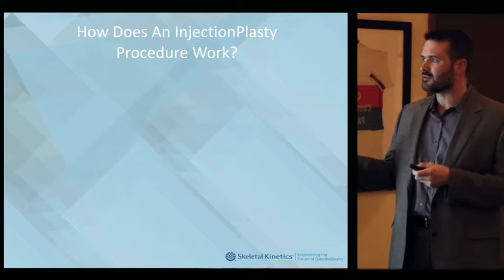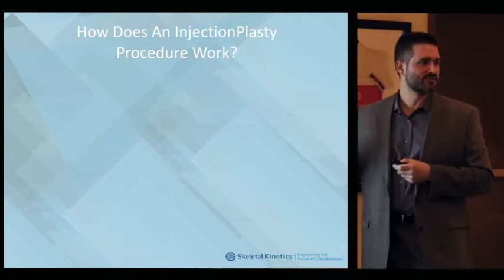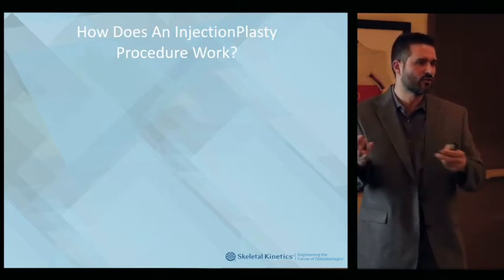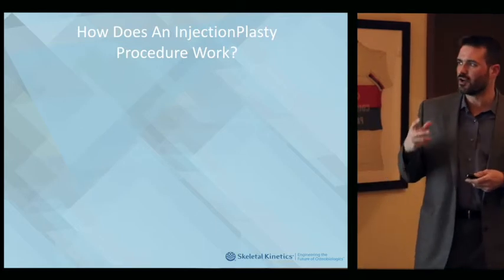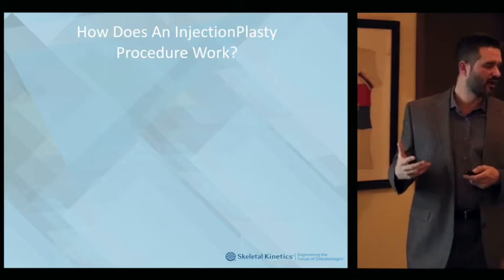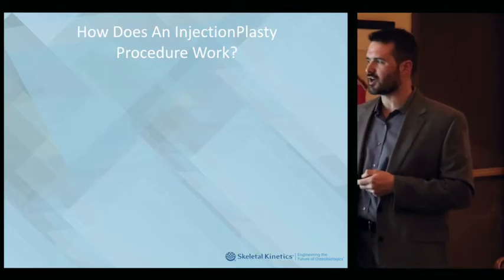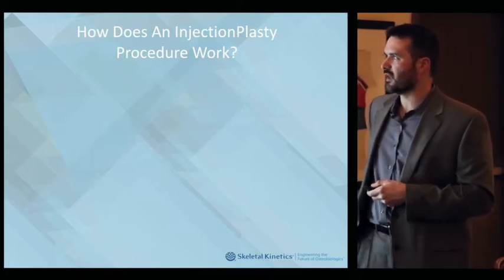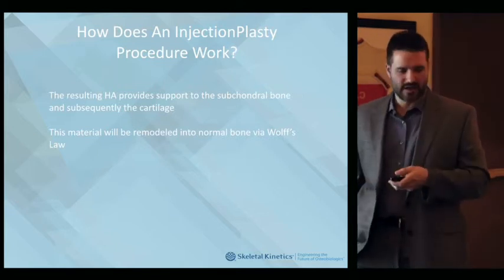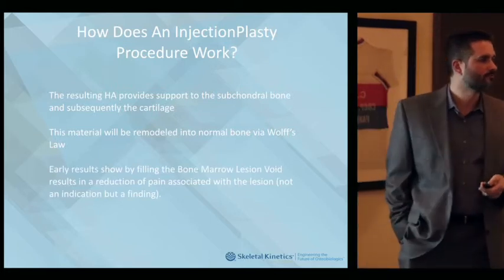And there's other products out there, and I've used several of them, but not for this specific purpose. Like if you have a distal radius fracture in an older person. But this works very good. It's easy to use through the syringe. And they're working on improvements on it right now. But I've had no real issues with it. I'll talk to you about a few, but nothing major that would stop me from using it. But it provides a support to the area, to the undersurface of the cartilage, and then the body's able to remodel to normal bone.